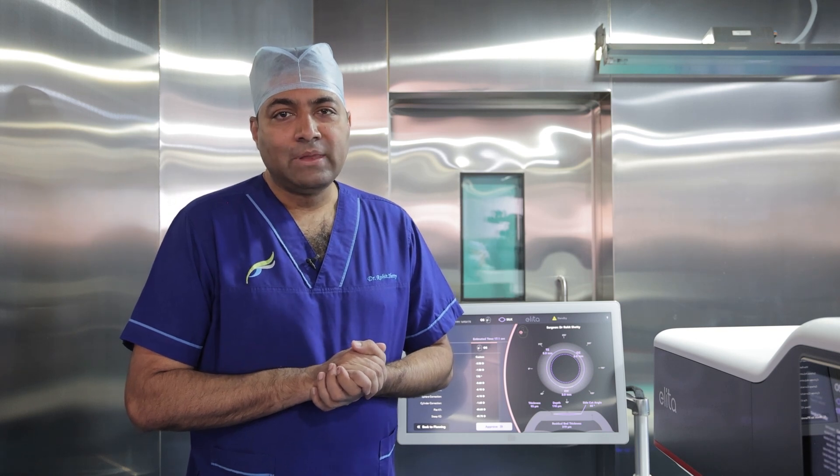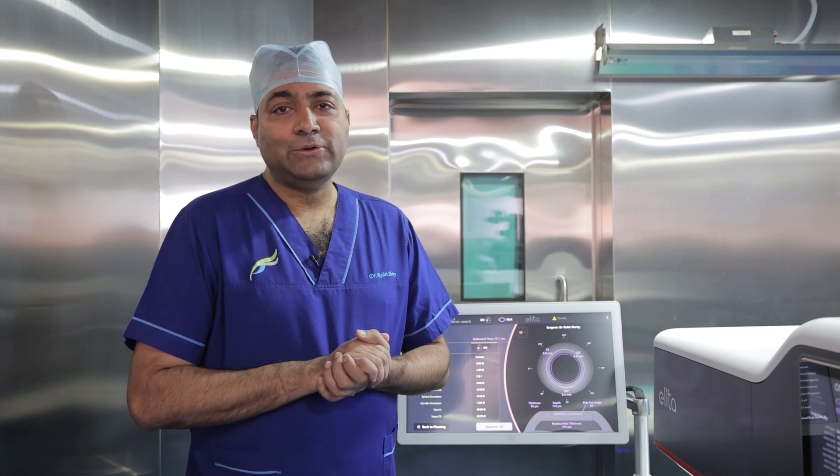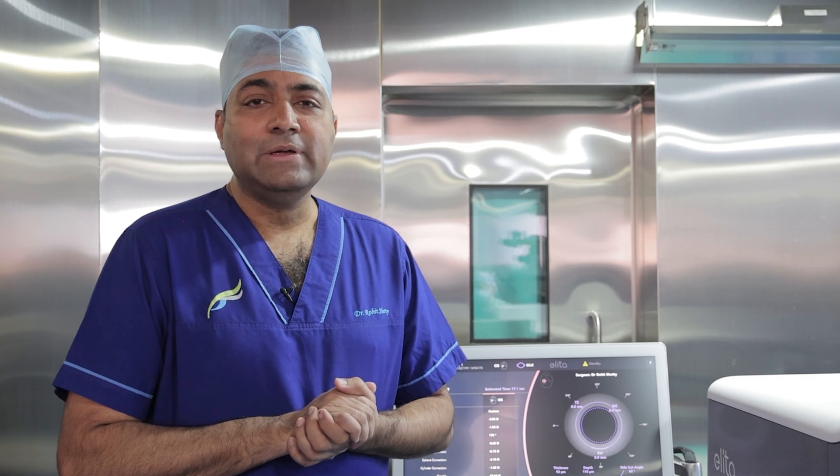Hello friends, I'm Dr. Rohit Shetty here. I represent Narayana Nethralaya, Bangalore, India. I'm very fortunate to demonstrate today the new lenticule extraction procedure from Elita SILK from J&J.